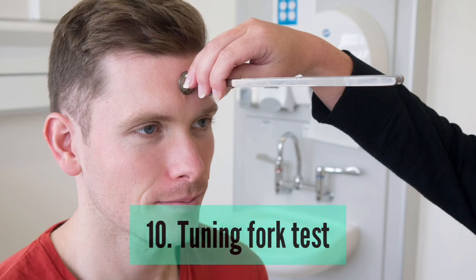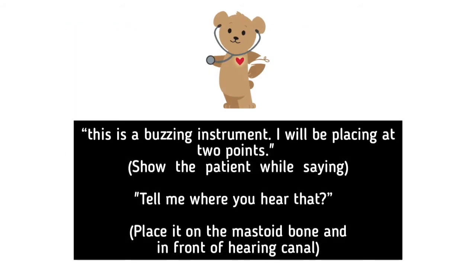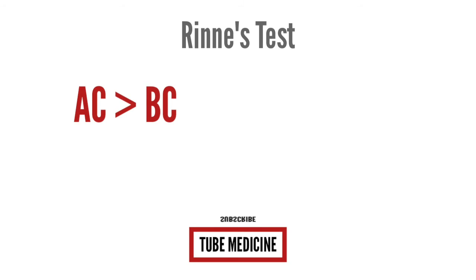Tuning fork test. Rinne's test: This is a buzzing instrument. I will be placing it at 2 points — show the patient while saying: tell me where you hear that. Place it on the mastoid bone and in front of the hearing canal. In an ear with normal hearing, and in an ear with sensorineural hearing loss, air conduction is more than bone conduction.